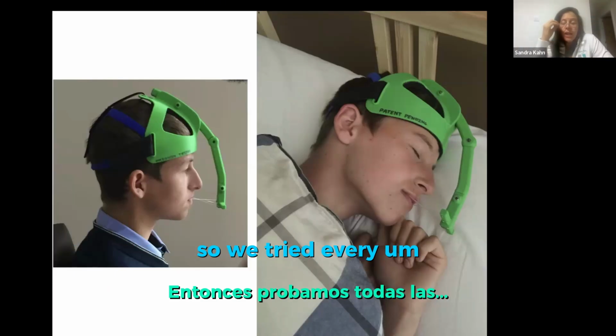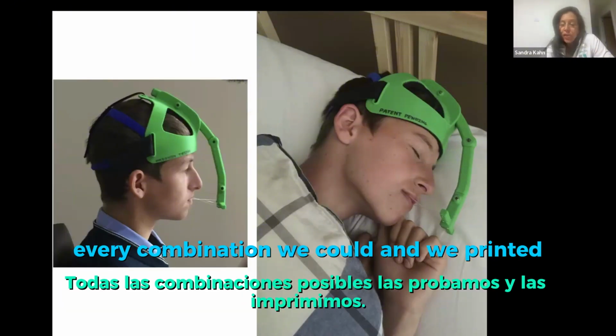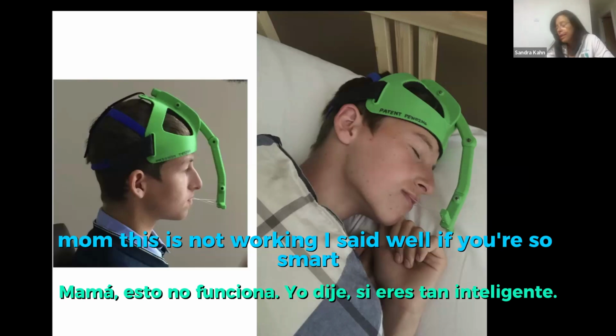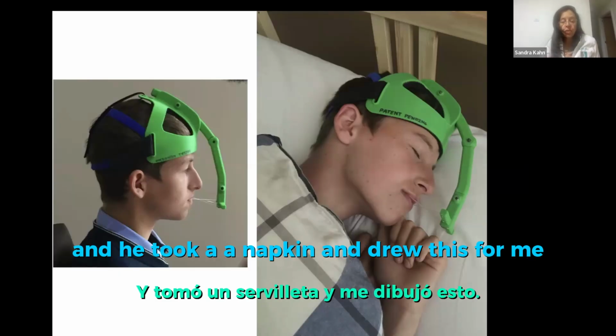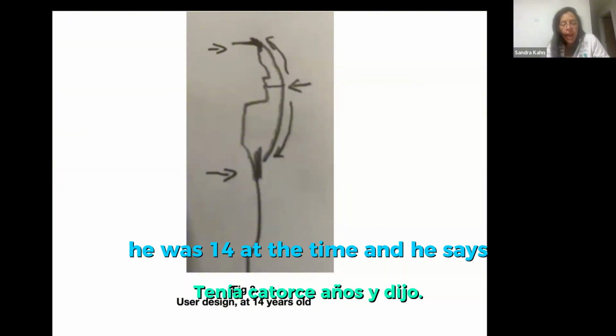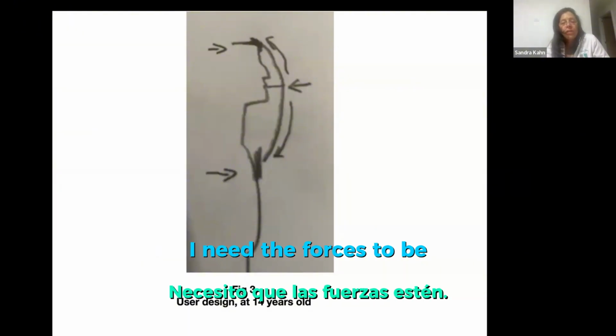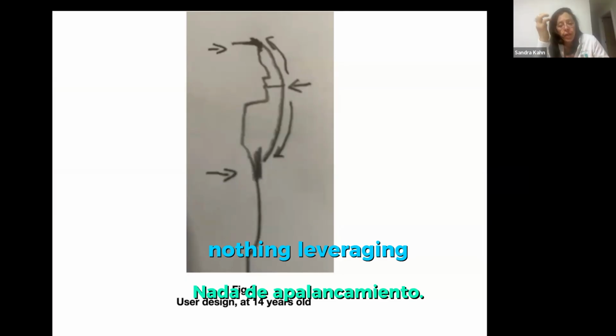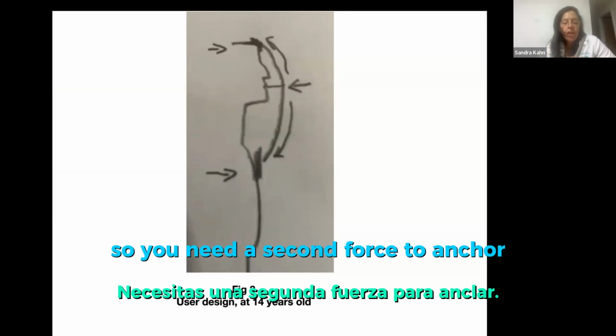So we tried every combination we could, and we printed tens, if not hundreds, of devices, until one day he said, "Mom, this is not working." I said, "Well, if you're so smart, what would you do?" And he took a napkin and drew this for me. He was 14 at the time, and he said, "I need the forces to be divided between my forehead and my chest. Nothing levering. So you need a second force to anchor."